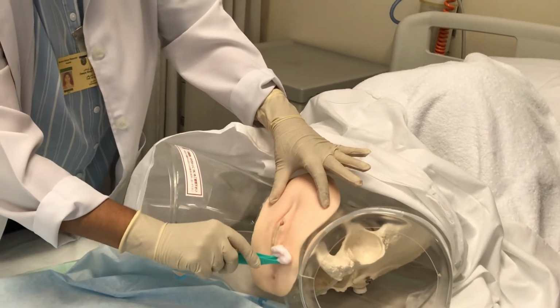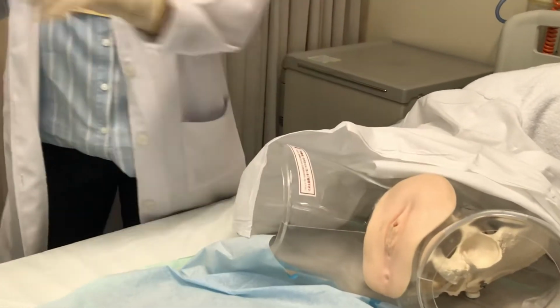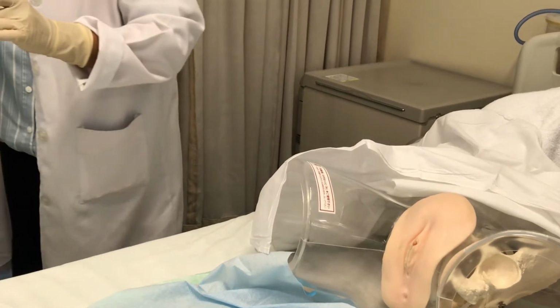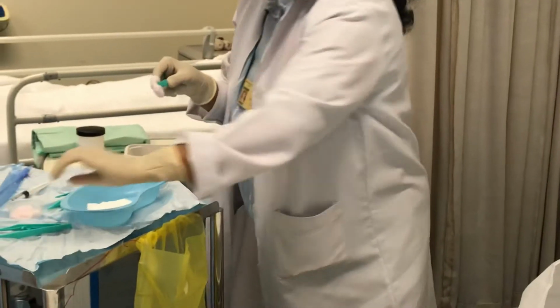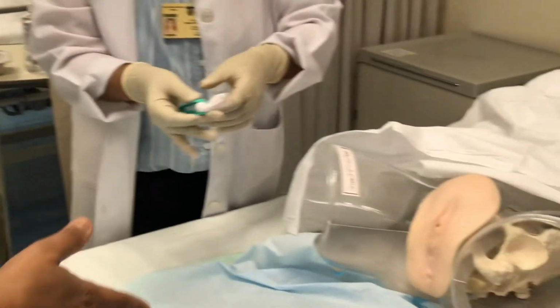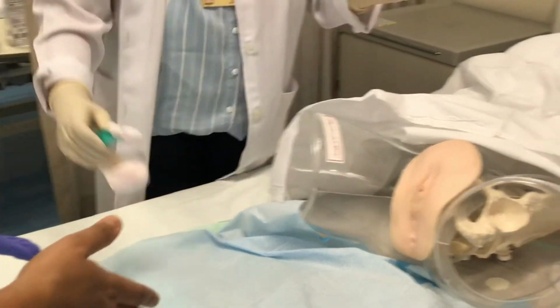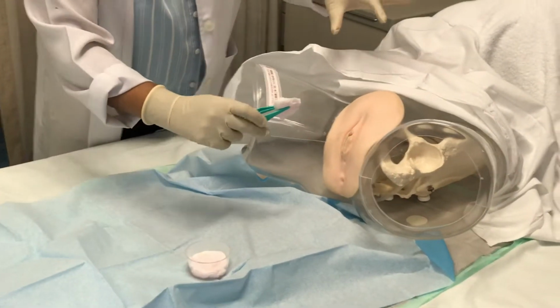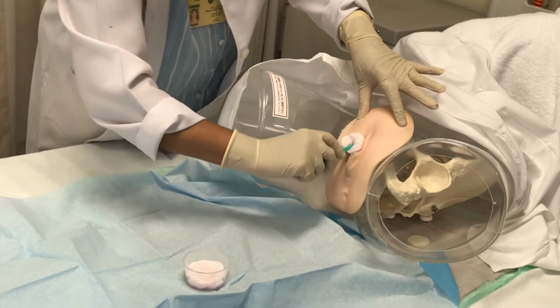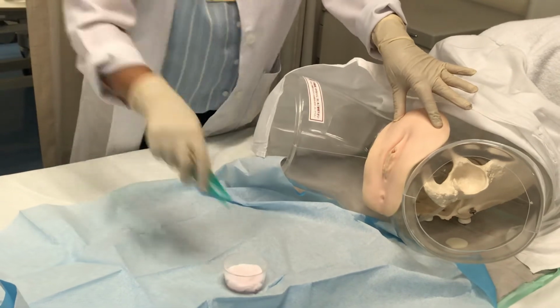So one swab, lengthy one. I'm just passing it, and throw it. This is just passing to the next one. So keep it there. You can even keep it there, it's easier. This will also be a sterile field only now. Yes, you can keep it here, it will be easier because we are crossing the hands, no? The next one, up. This is the labia majora. Down. Yes, like that.